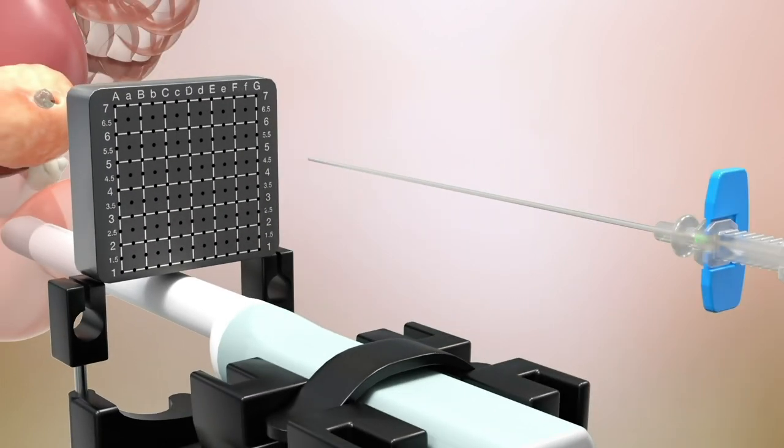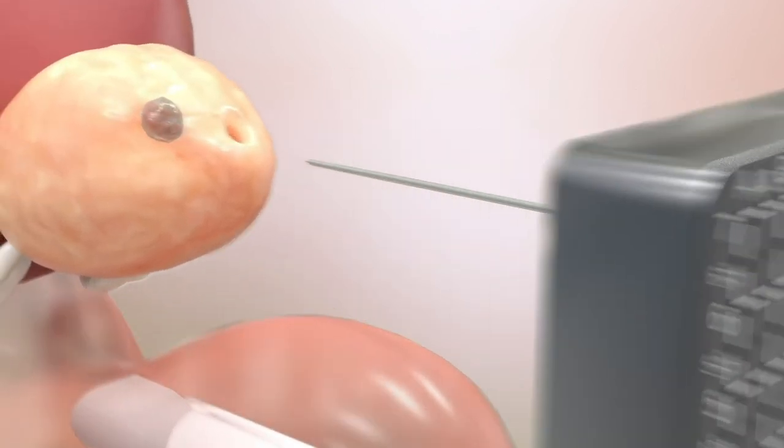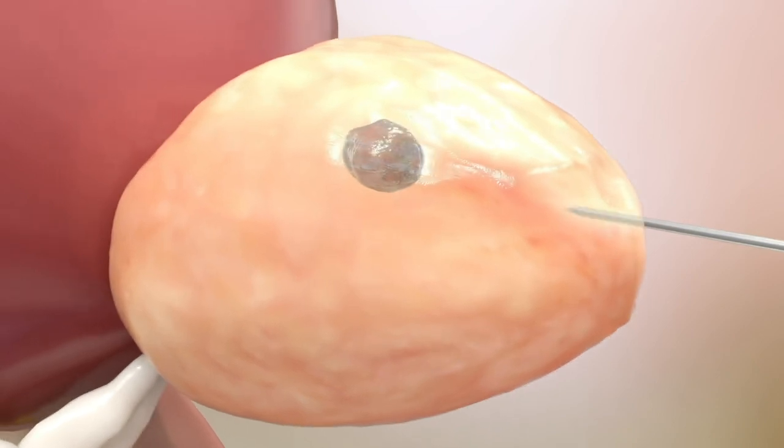Using given template coordinates, the doctor then inserts the laser catheter with the stylet via transperineal access into the target coordinates to the proximal edge of the tumor.